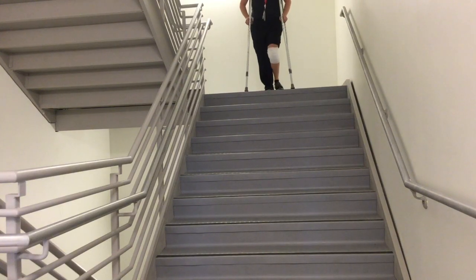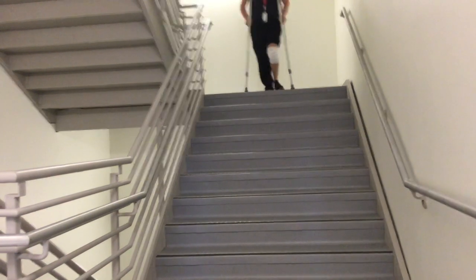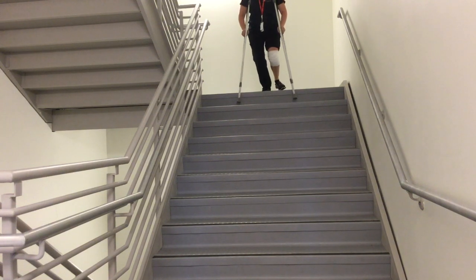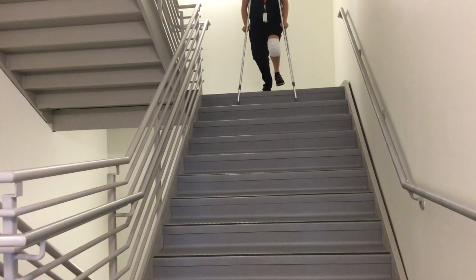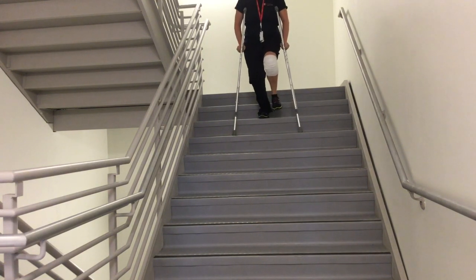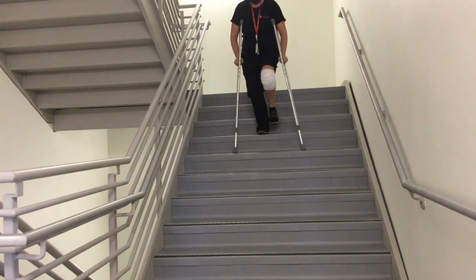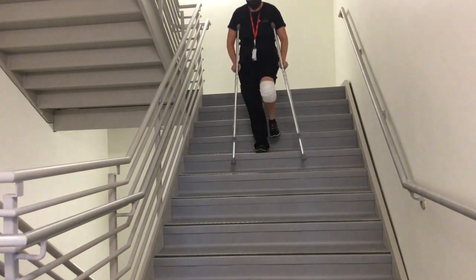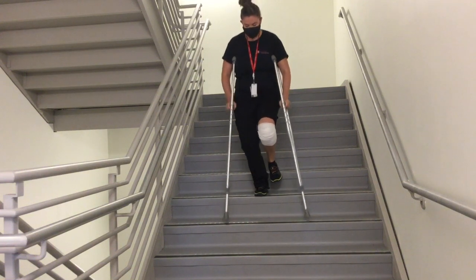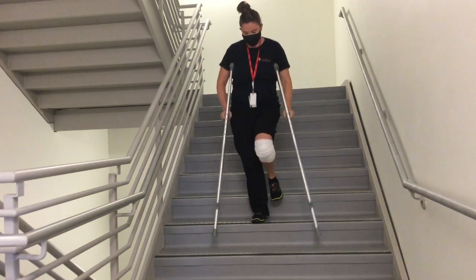Descending stairs with crutches. Instruct the patient to start in the tripod position and shift the body weight onto the uninjured leg. Have the patient bend the strong knee while moving the crutches and the injured leg to the stair below. Shift the body weight to the crutches and then bring the uninjured leg to the step. Continue until you reach the bottom of the stairs.